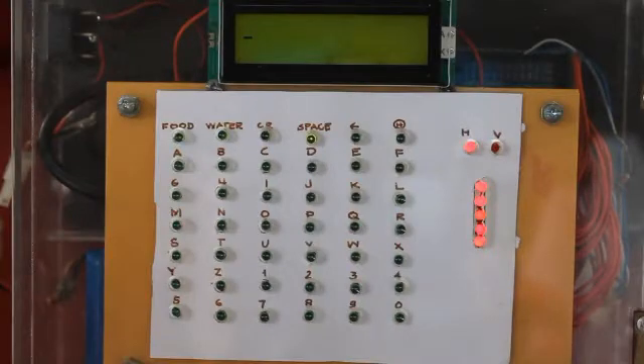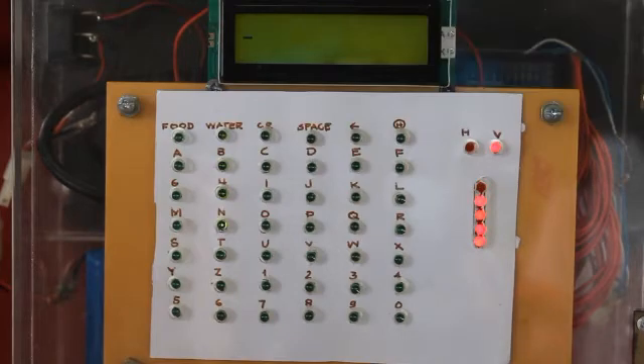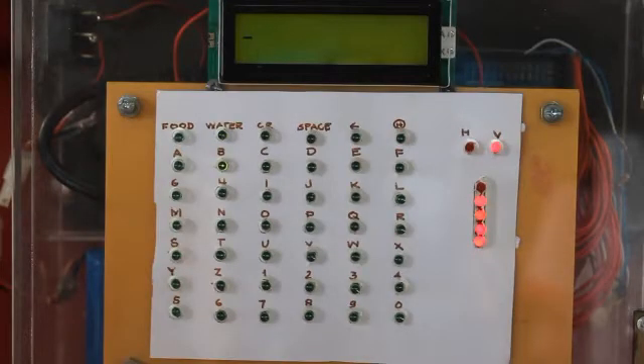As said earlier, the HV LEDs are being controlled by blinking. Once he blinks, the H LED toggles to V LED, which means vertical LED shifting. And when he starts focusing again above threshold, we can see that the green light shifts in a vertical manner. With these combinations of focusing and blinking, the user can now navigate the light to the character that he wants.